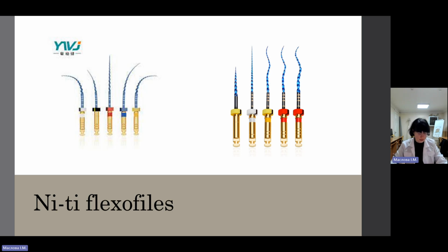The NiTi alloys have many interesting properties: shape memory effect, the ability to return perfectly to its original shape. You can see on this scheme how the NiTi files can return to their original shape after usage. Also super elasticity, low modulus of elasticity, good biocompatibility, and high corrosion resistance.